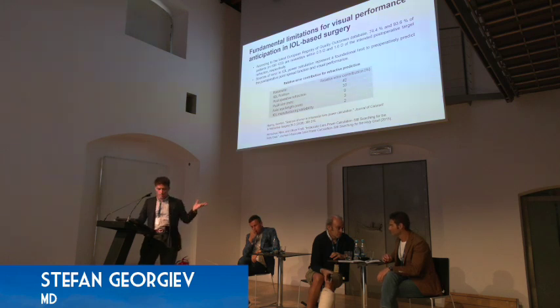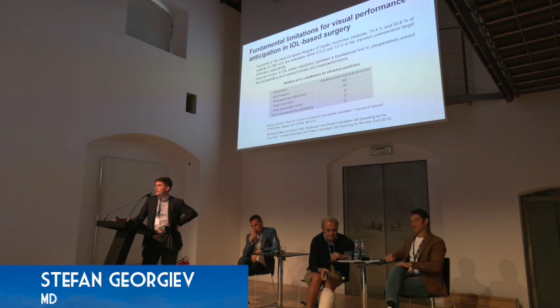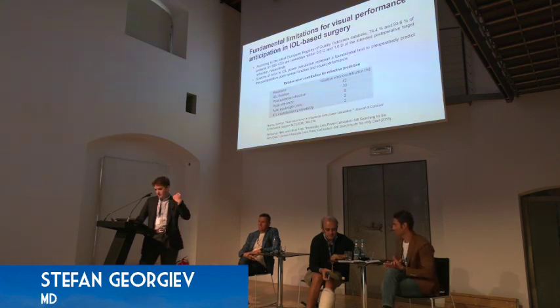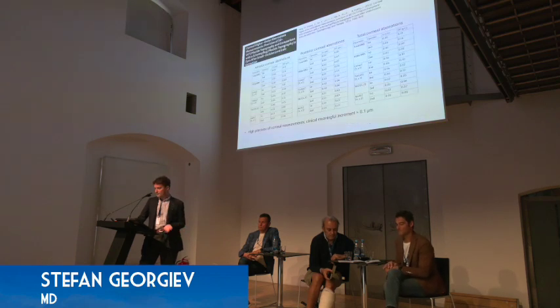And as Giacomo already previously explained, the prediction of the lens position is the foundational error, the main source of error contribution to any lens power calculation formula. But the second biggest source on average is the post-operative refraction itself. There is post-operative refraction variability which these formulae are optimized for, and this will hinder the improvement of refractive predictability no matter what you do.